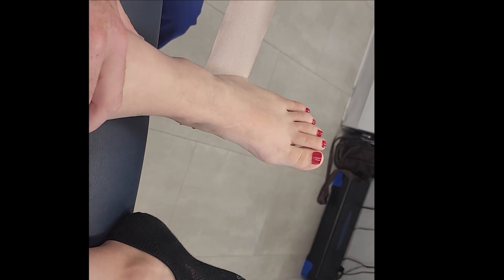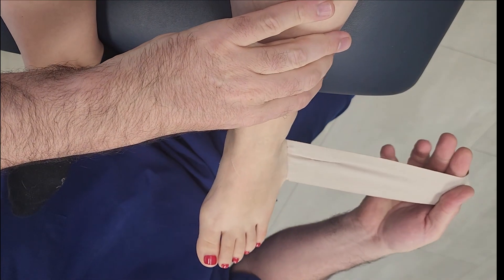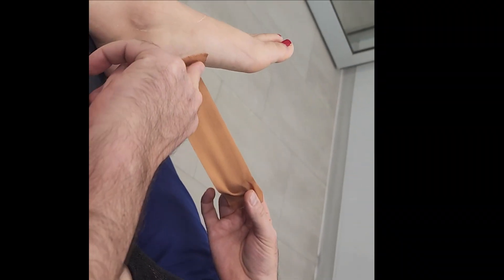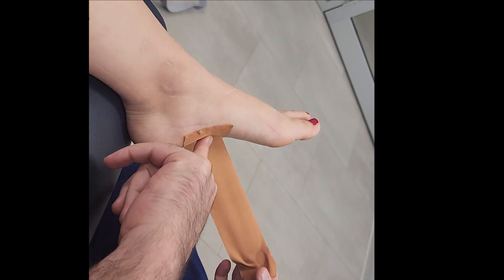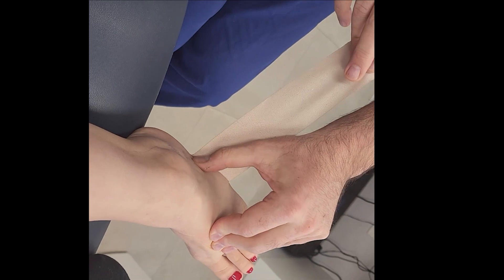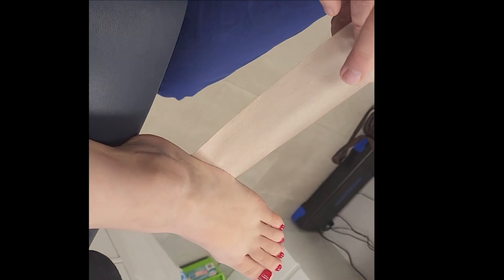This taping can also be combined with taping that plantar flexes the first ray. Let's go through that taping method. We start on the plantar medial aspect of the arch, around the talonavicular joint, then we go laterally to the level of the calcaneal cuboid joint.